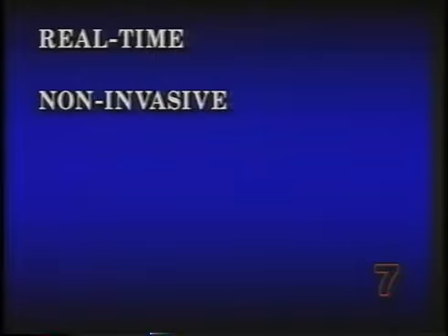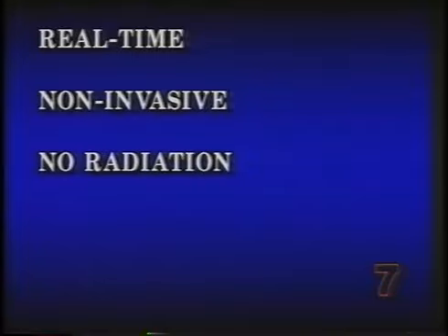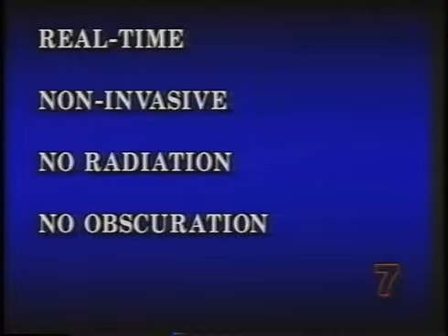Ultrasound has a number of advantages or strengths as a measurement system in the vocal tract. The first is that it's real time. This allows us to measure speech as it's actually being spoken. We don't have to sustain sounds. The second is that it's not an invasive technique. It's a very comfortable procedure, and it doesn't involve any radiation. So that allows us to have long recording sessions, to use multiple repetitions, to not worry about patient comfort or biohazards.